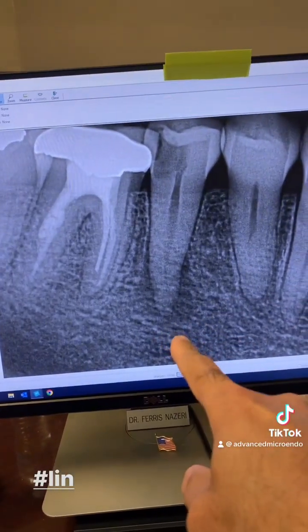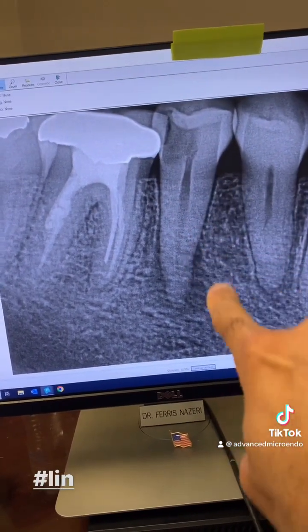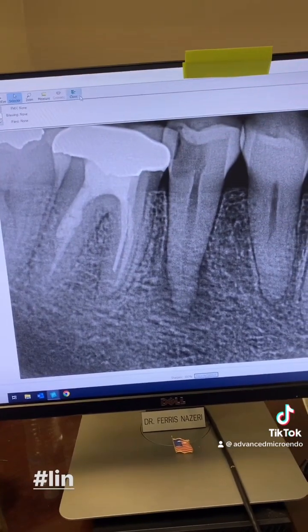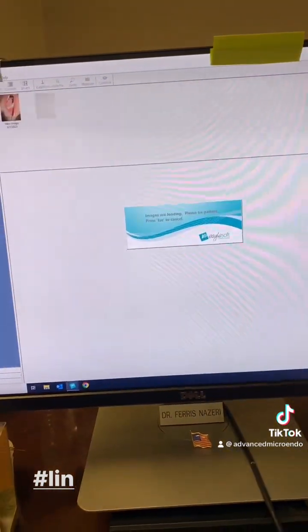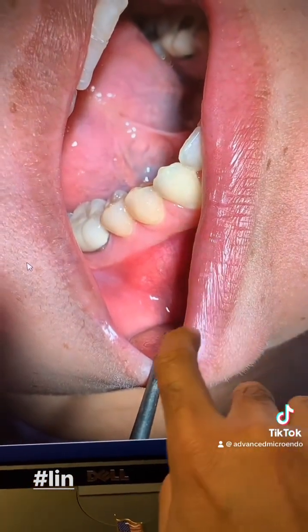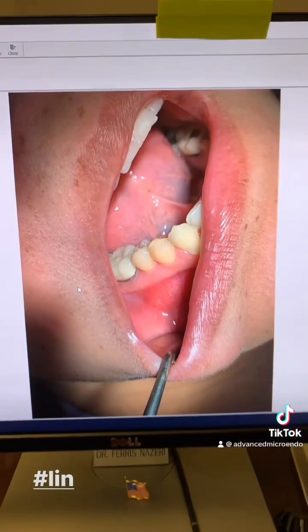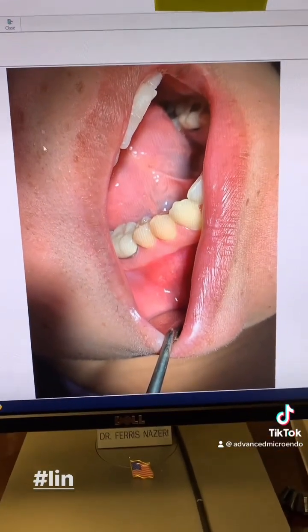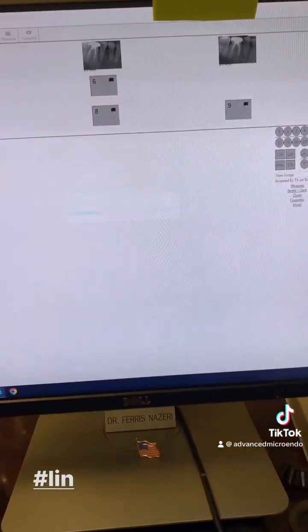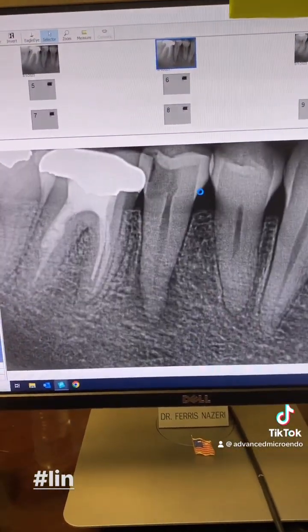Now look at this tooth here. You can see decay into the pulp and peripheral lucency. There was also buccal swelling — as you can see, that's a pretty decent size swelling. That's the tooth. Even with this tooth, I'm envisioning the possibility of having to use MTA.